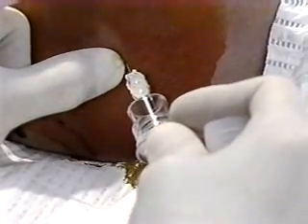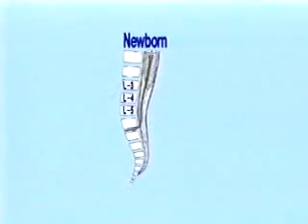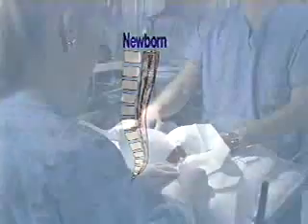If no fluid is obtained, or if the fluid is bloody, the practitioner may attempt the puncture one space above, at the level of the iliac crests, or one space below the initial puncture. If unsuccessful on the first 2 or 3 attempts, someone else should make the puncture.